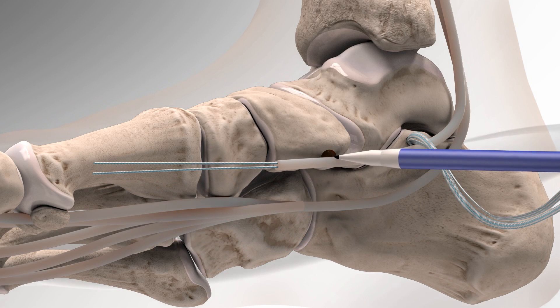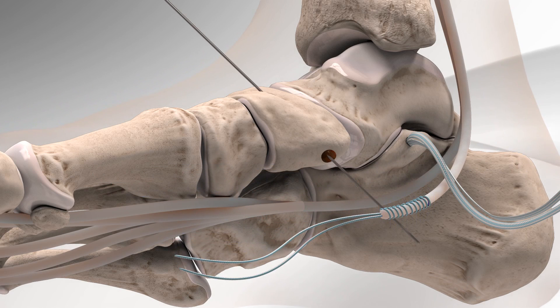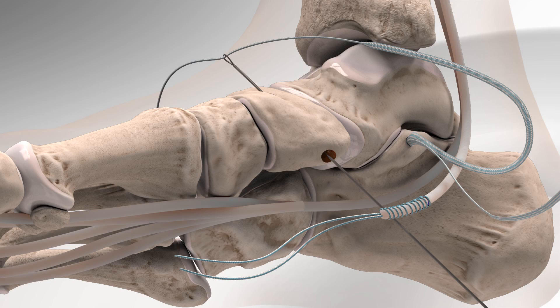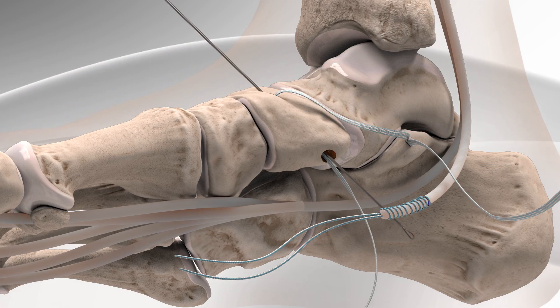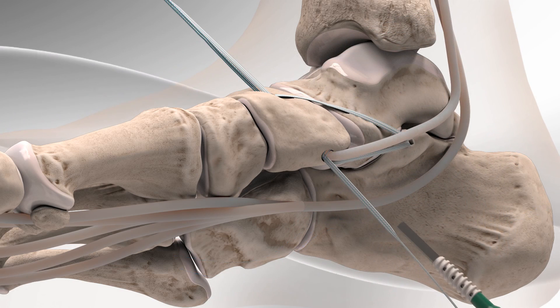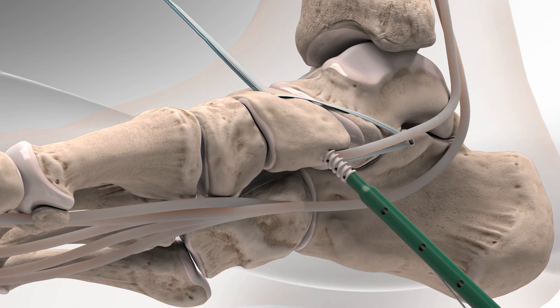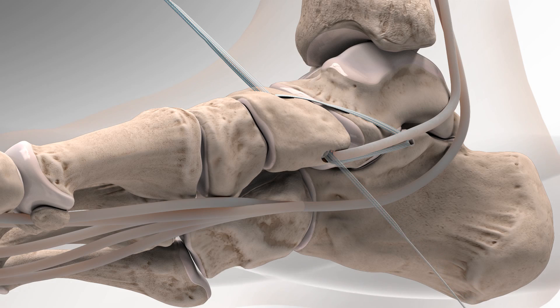The ankle structures are tensioned and fixed into place by taking one part of the fiber tape and passing it from top to bottom with a suture passing wire. Then, the other part of the fiber tape with the sutures from the FDL tendon is passed from bottom to top. The surgeon holds it in place by inserting the swivel lock from bottom to top, and the remaining sutures are cut.